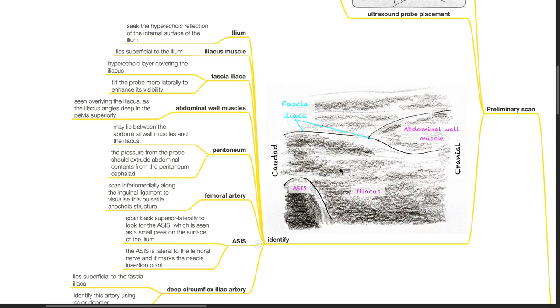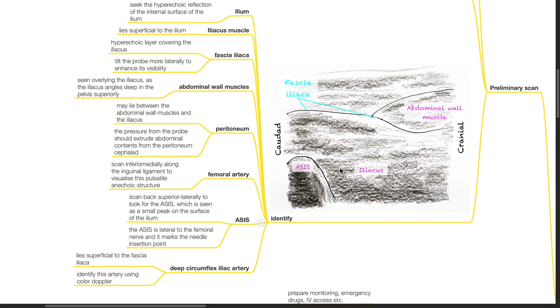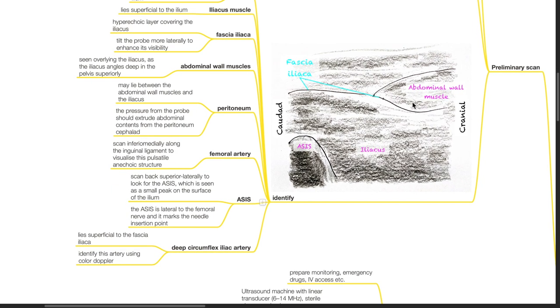Tilt the probe more laterally to enhance its visibility. Abdominal wall muscles may be seen cranially. It is seen overlying the iliacus as the iliacus angles deep into the pelvis superiorly. The peritoneum may lie between the abdominal wall muscles and the iliacus. Pressure from the probe should extrude abdominal contents from the peritoneum cephalad.